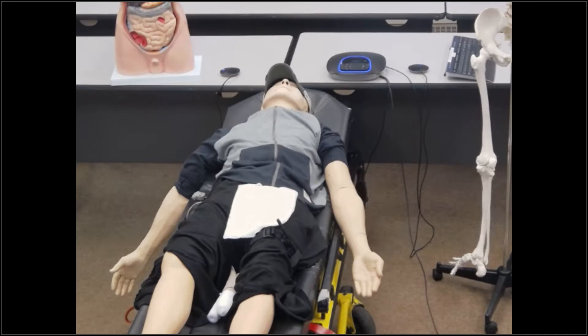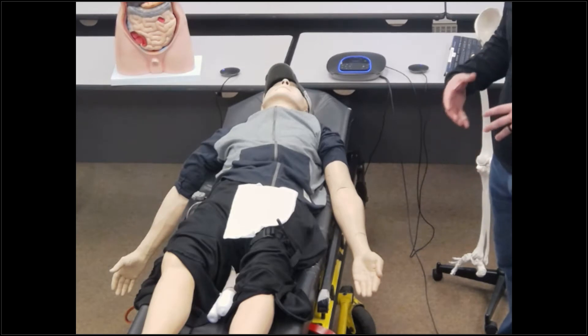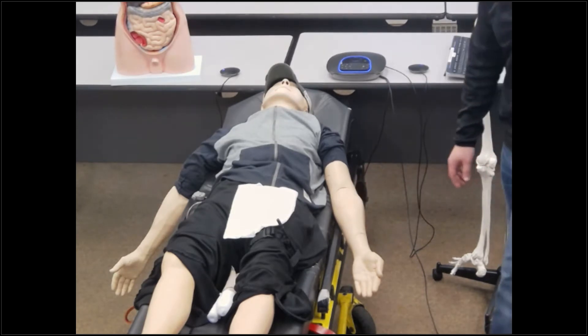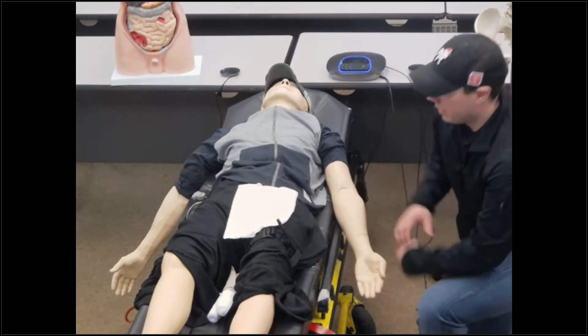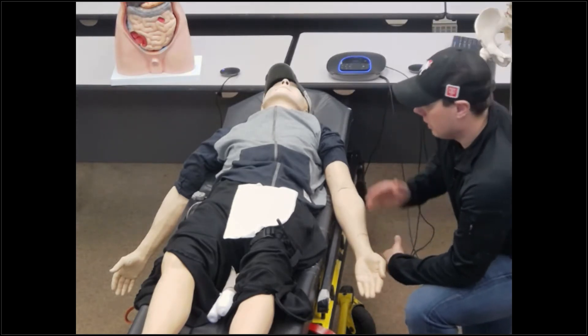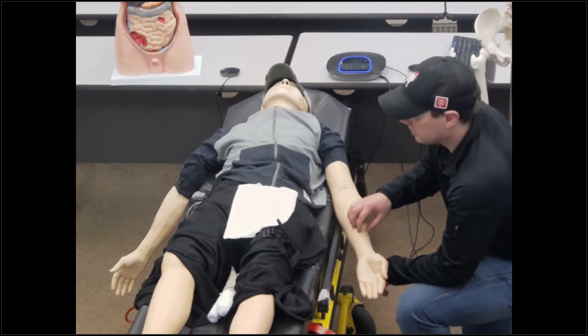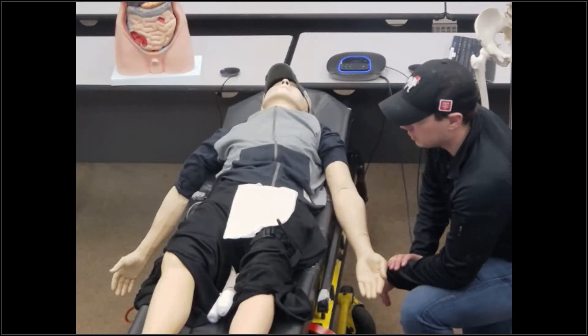We have a 24-year-old male patient who cut their arm on a fence, and there's a deep, short laceration on the lower portion of the arm. I've got my BSI on, my scene is safe. I introduce myself to my patient. I have an isolated injury with heavy bleeding coming from here, but it's not so substantial that I think I immediately have to apply a tourniquet at this point.